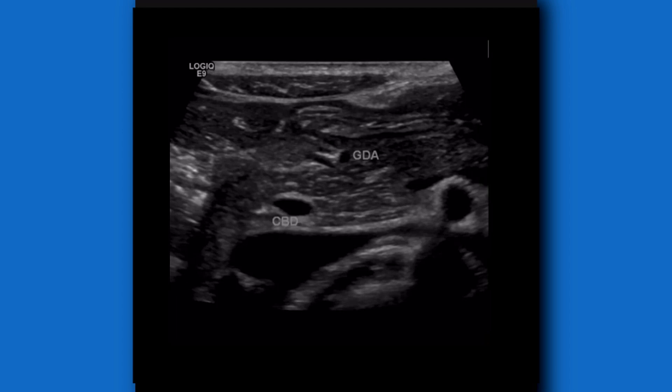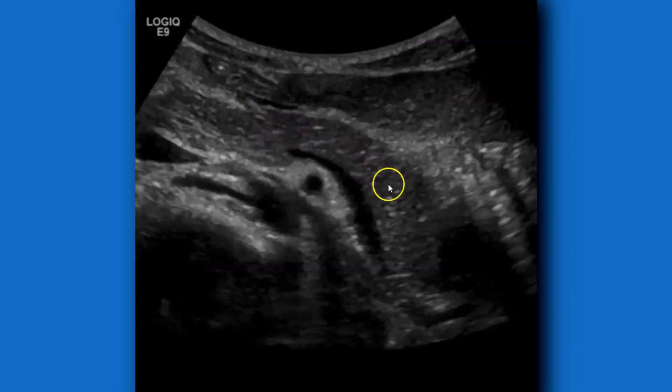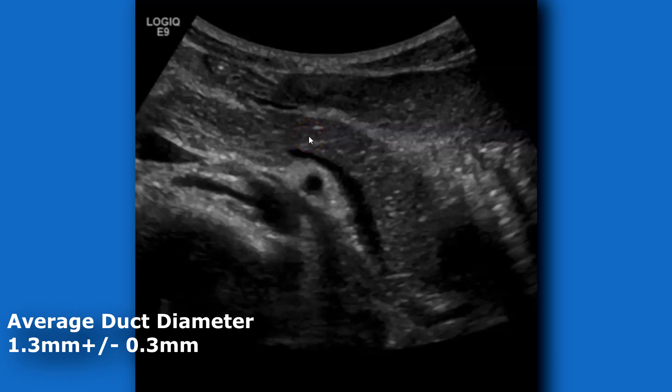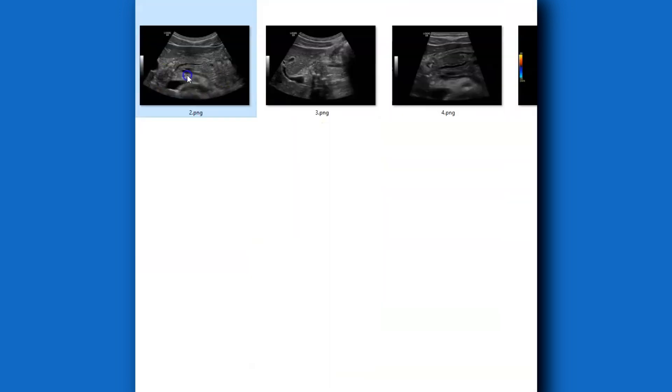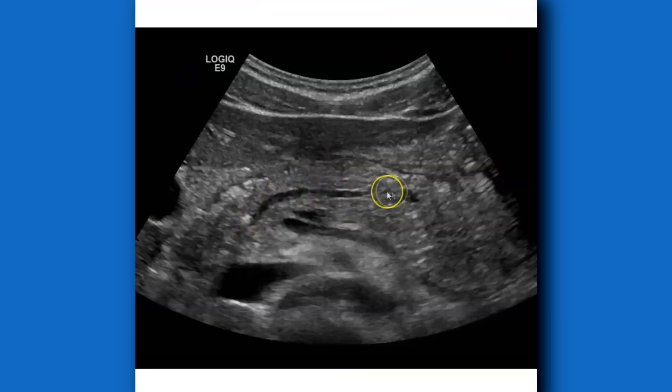Anteromedially you'll have the gastroduodenal artery — not imaged here. So you have those two little circles in the head of the pancreas. Around here will be the pancreatic duct — the main pancreatic duct — normally one millimeter or less, though some use two millimeters as the upper limit of normal. Here's a dilated pancreatic duct with a calcification; this is chronic pancreatitis.